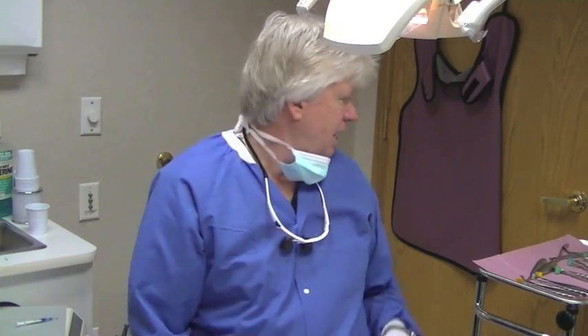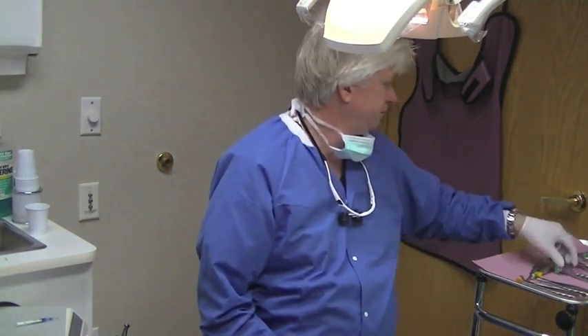As I mentioned in many of the videos, maintaining the buccal plate or buccal bone is really gold for us. Our patient today will receive a full upper maxillary immediate denture and a lower immediate partial denture. We're going to keep a few of his teeth, but this will really show us how to use the tools correctly. And as we've talked about in the past, the physics forceps is rather unique.